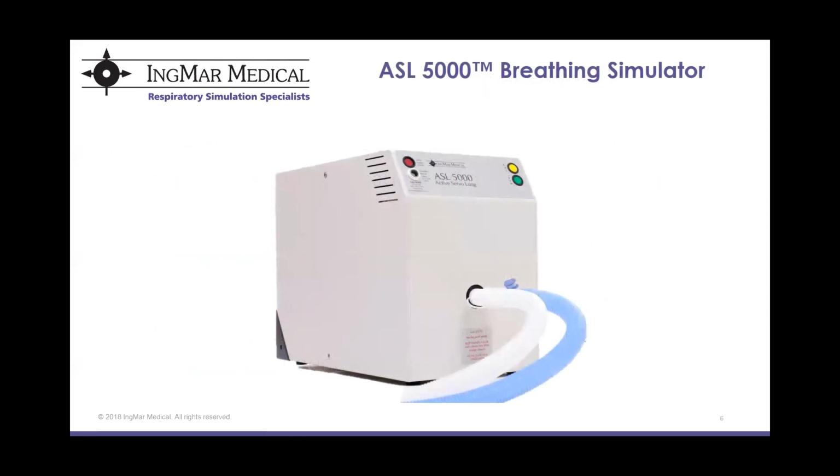Before we dive into the scenario, I'd like to give you some context on the ASL 5000 breathing simulator and how it works. I know we have quite a few users of the ASL 5000 in the audience today, so bear with me for a moment if a little of this information is redundant for you, but we'll move into the live scenario momentarily.